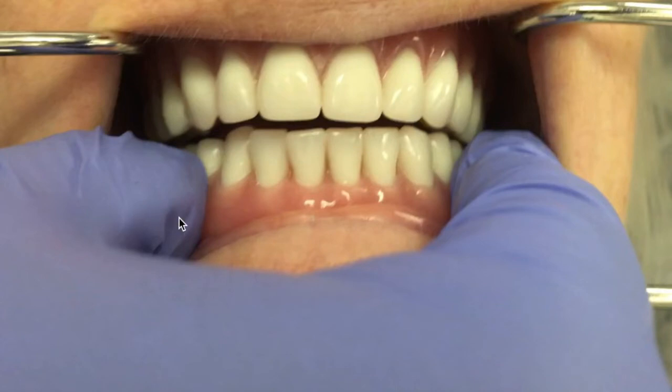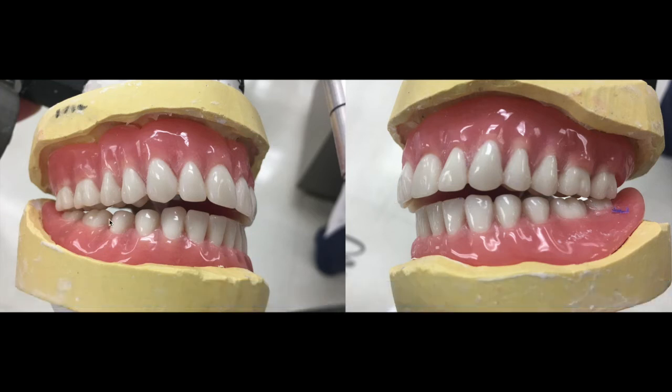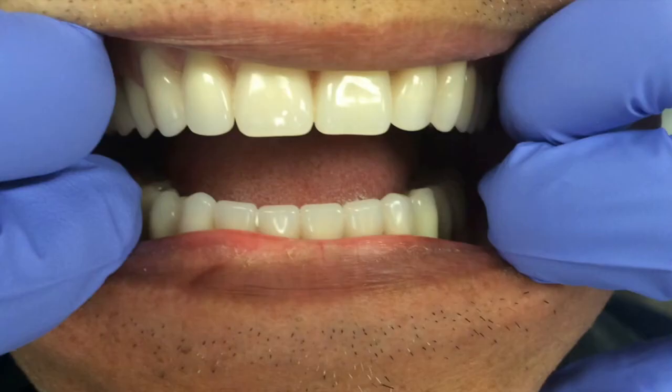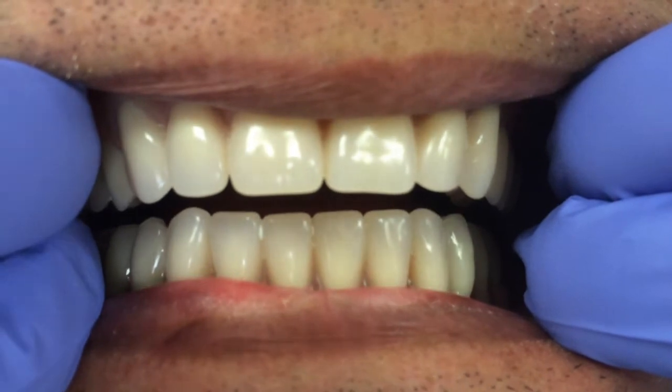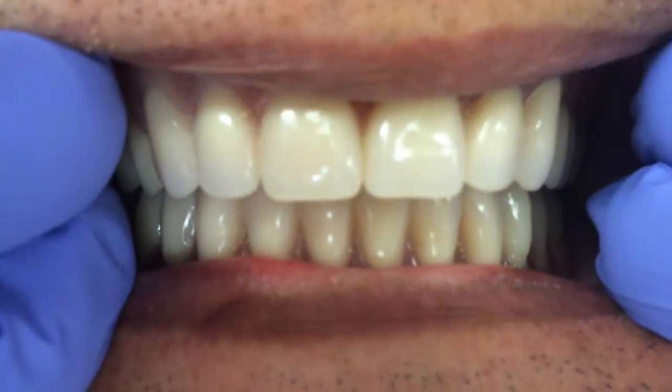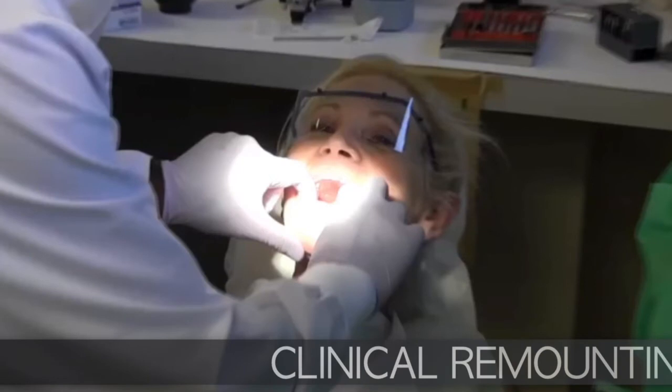After clinical mounting, this patient showed only one tooth touching — a premature contact with no other contacts — which required significant adjustment. If you observe a large occlusal discrepancy, you may need clinical remounting so that you can adjust the occlusion outside of the patient's mouth.